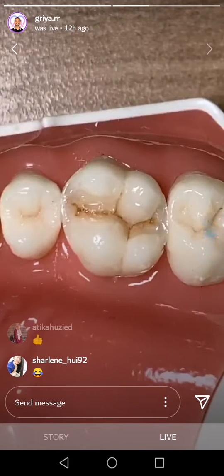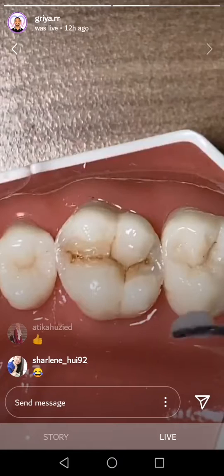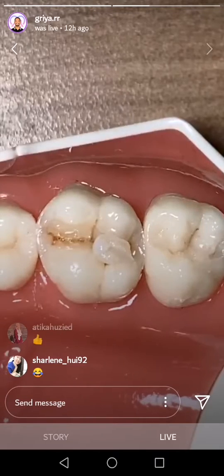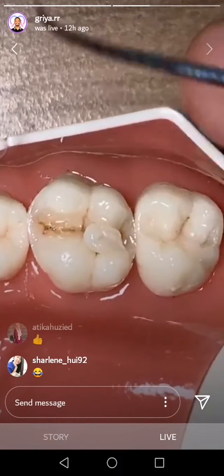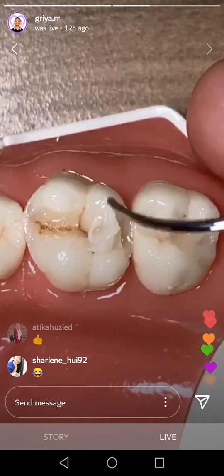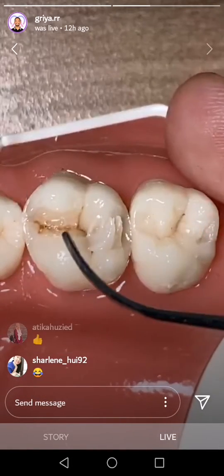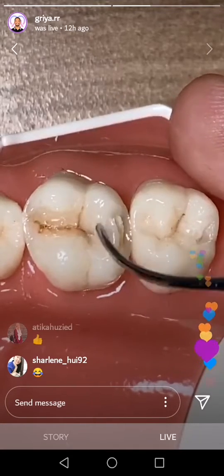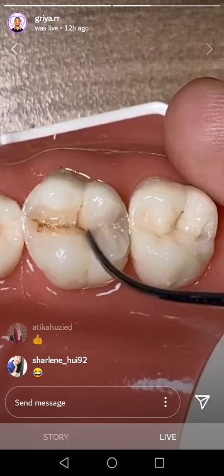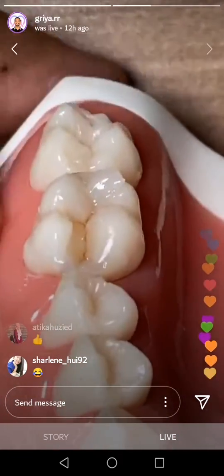After this I love to fill this one. Okay, distal. Like this, yeah. Then what is this? Hair. Okay, push again like this. Push like this. Free. See from here, yeah. See.